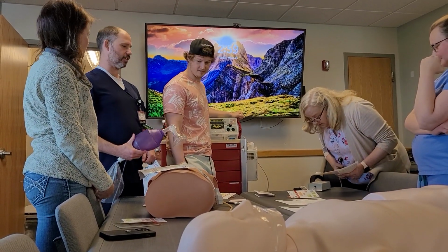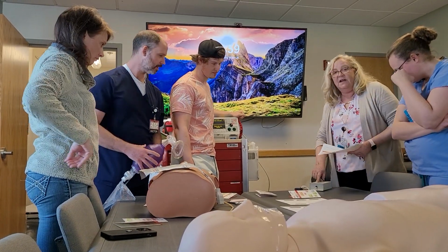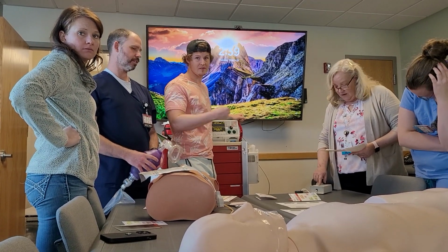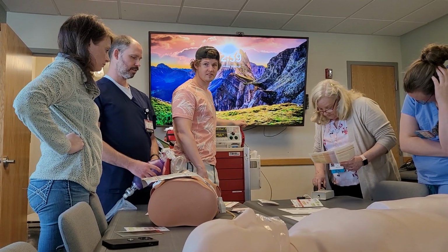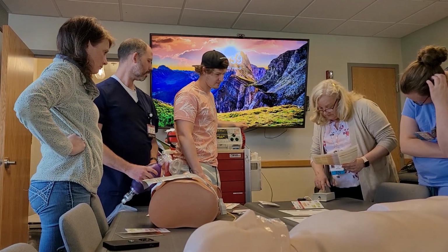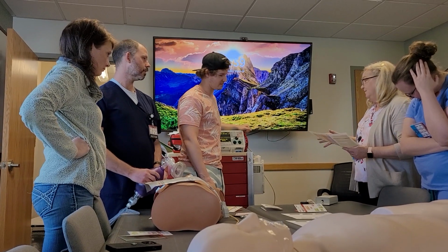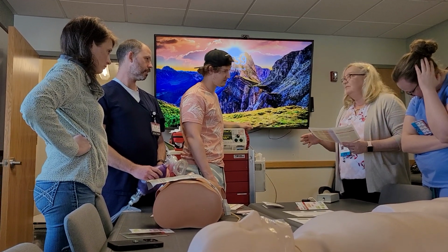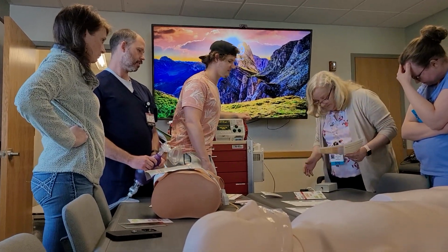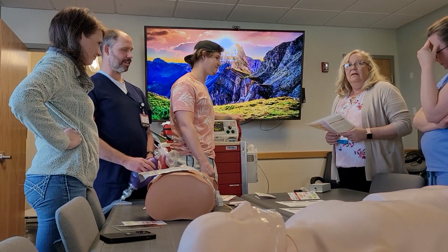Let's check the blood pressure first. Yeah. What's PSVT on here? Paroxysmal supraventricular tachycardia. Yeah. Okay. Ventricular tachycardia. Okay, so it's supposed to be just VTAC. Sinus tachycardia. There isn't one on there. We'll see there. Okay. Sinus tachycardia.